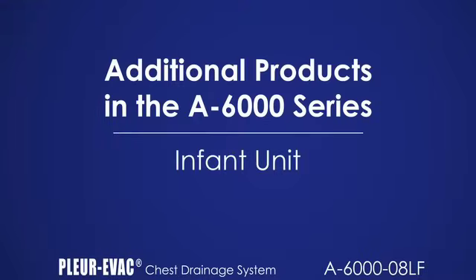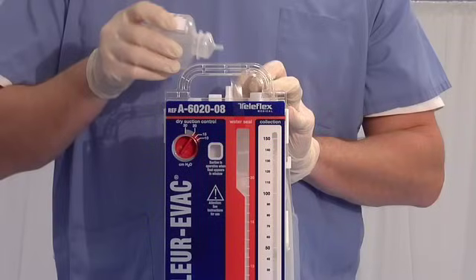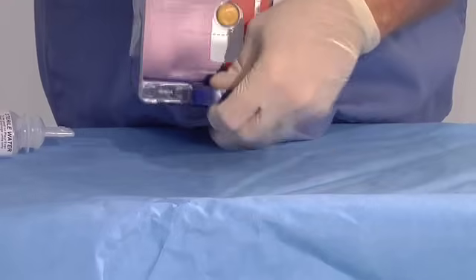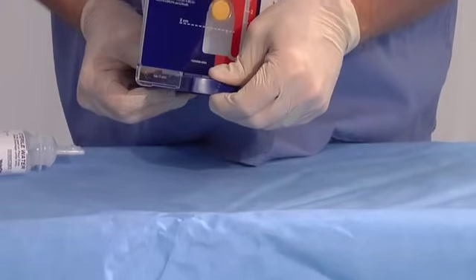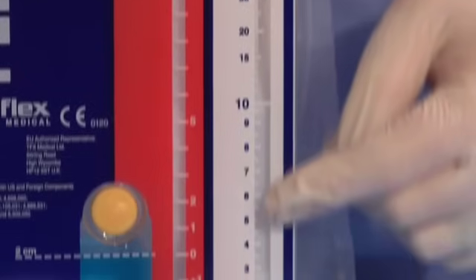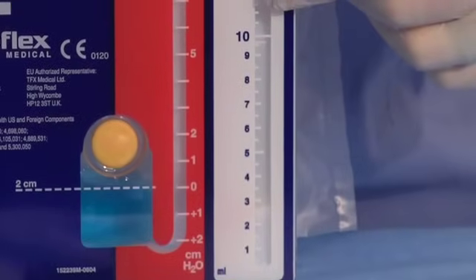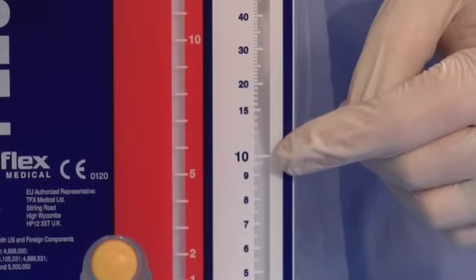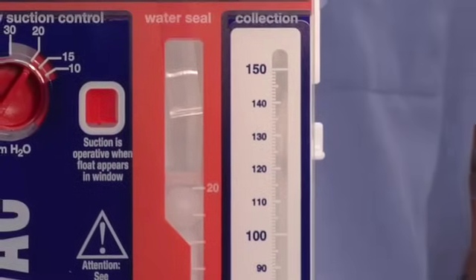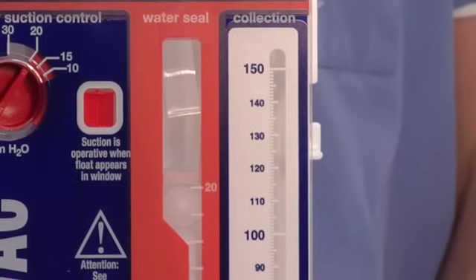The A6020-08LF is specifically for infants. It sets up the same as the A6000-08LF. Activation of the floor stand is similar to the A6000, with additional telescoping length provided to enhance stability. The collection chamber on the A6020-08LF is much smaller, with increments of ½ cc to 10 cc, and 1 cc to a capacity of 150 cc. The dry suction control operates up to 30 cm of water.